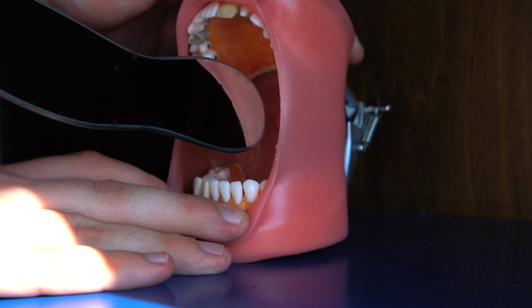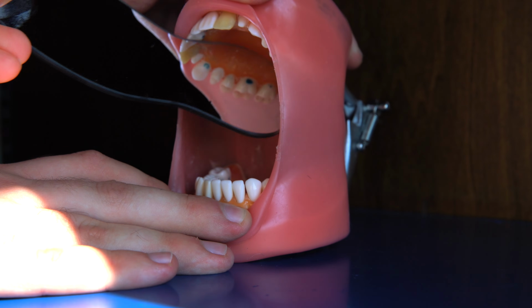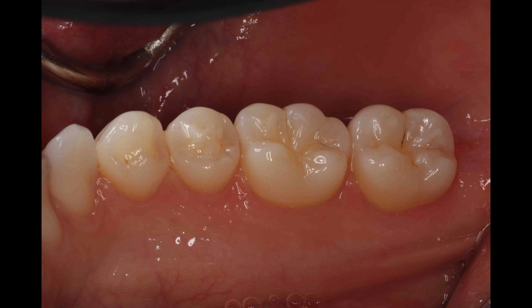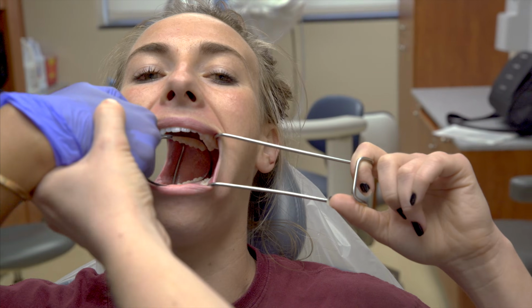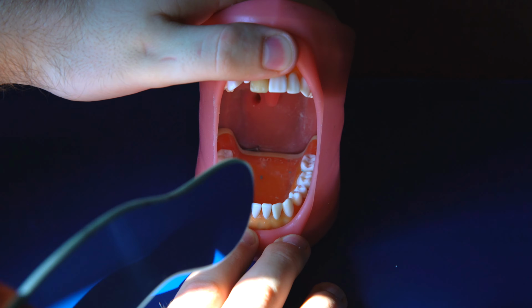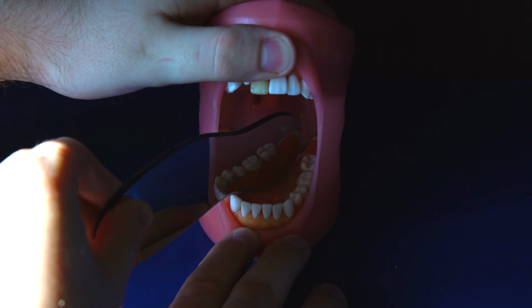Again, here's the same technique but on the contralateral side. This is a decent photo. However, in this second photo, you see more of the occlusal plane. To correct this, just angle the mirror more parallel with the long axis of the tooth. Or, in other words, tilt the top of the mirror slightly towards the contralateral side.